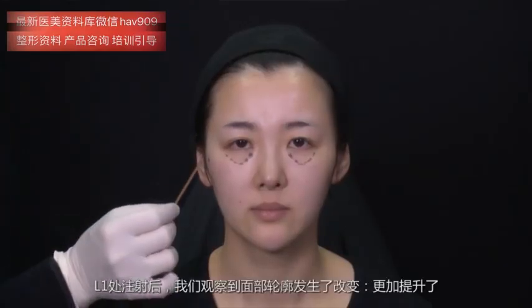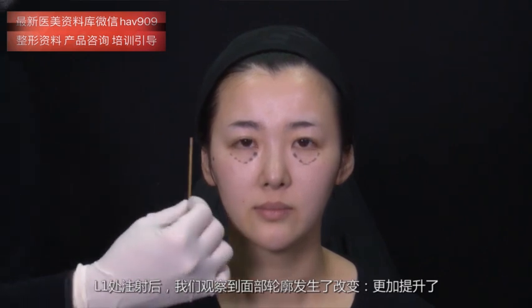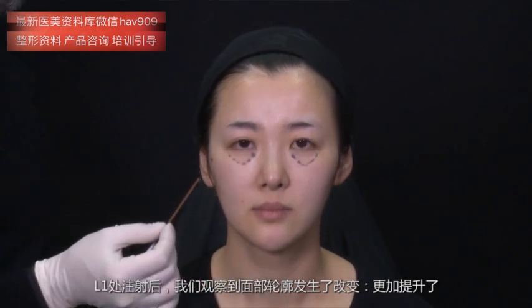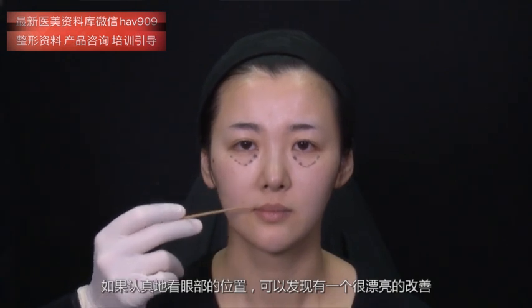So now, after injecting L1, we notice the change in the shape of the face. It gets more lifted. Also observe what happens to the junction, and observe what happened to her eyebrows. If you really look at the position of the eye, we notice a very beautiful improvement.